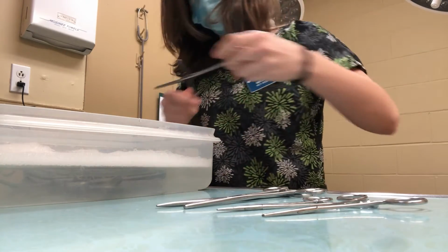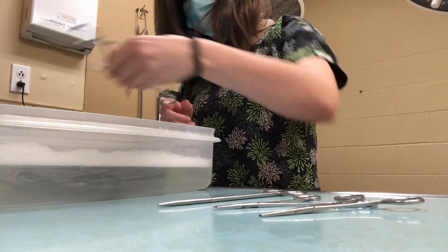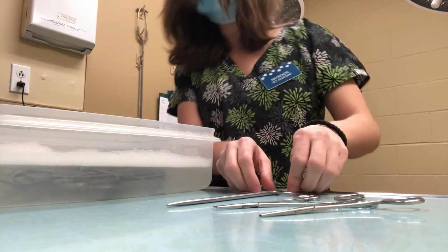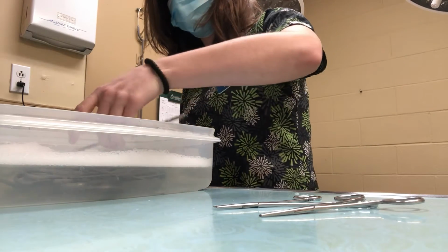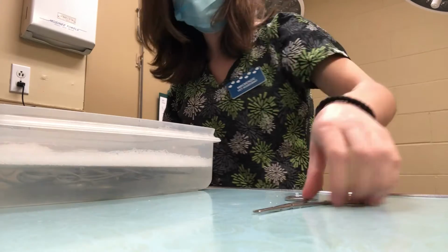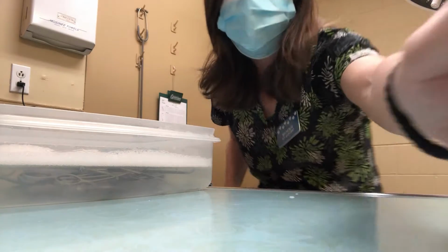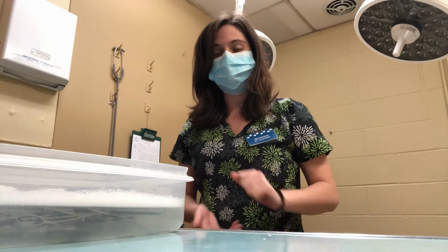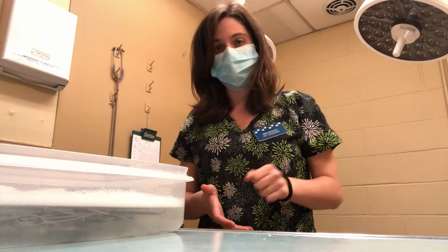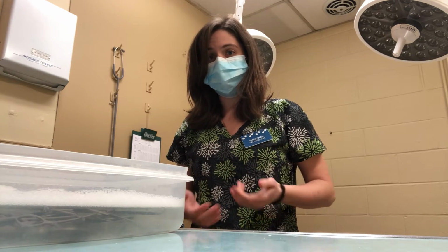We're going to do the pre-cleaning, which is manually washing, rinsing the instruments with distilled water and using a gentle brush to scrub away any of the debris and dried blood. And then we'll go into the decontamination process where we use a detergent to gently scrub the entire instrument by hand. And then finally, they are ready to go into the autoclave.